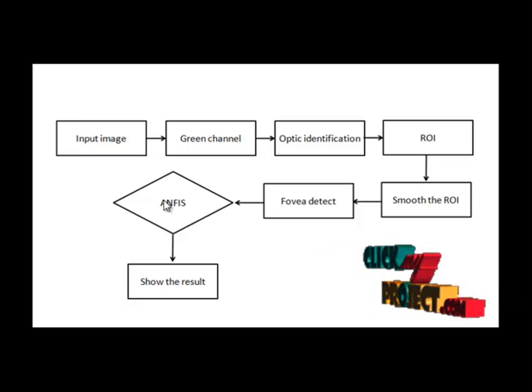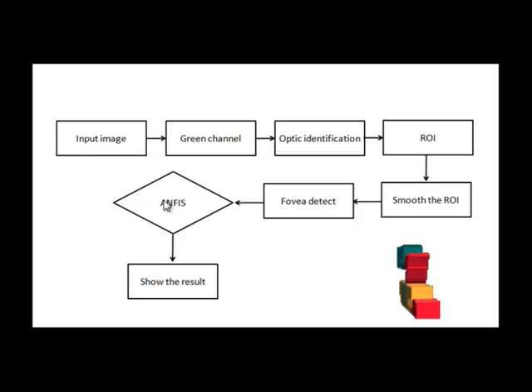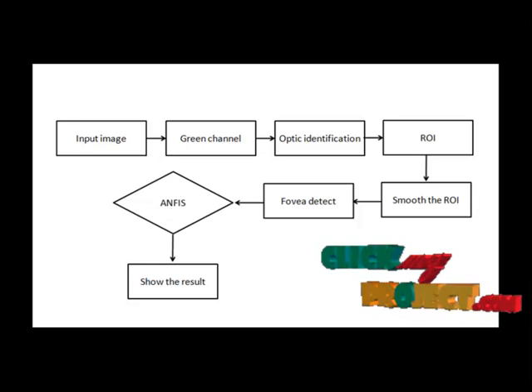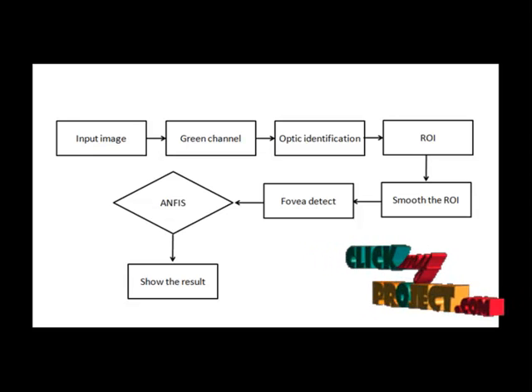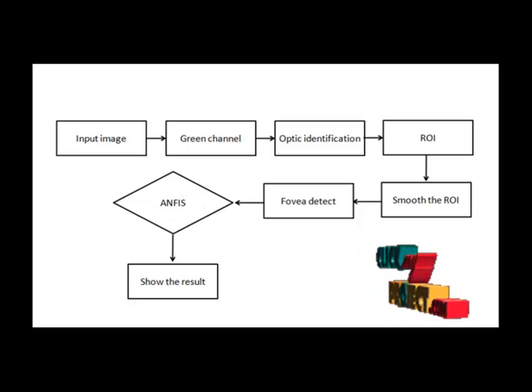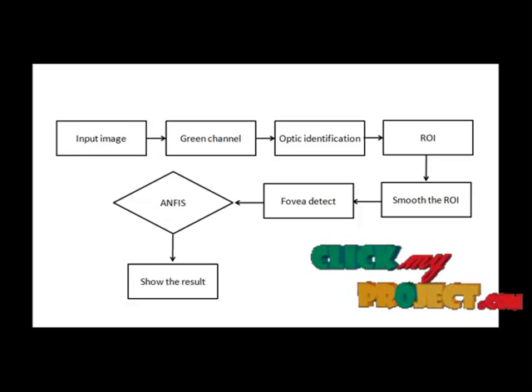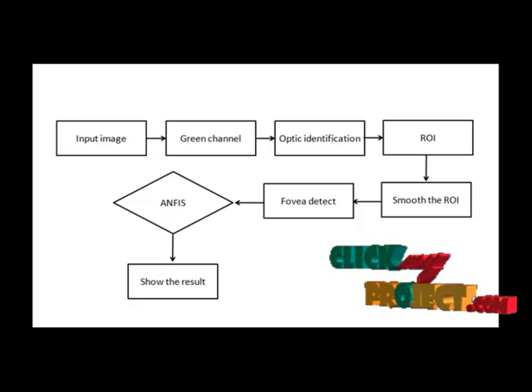When the gradient vector is obtained, any of several optimization routines can be applied in order to adjust the parameters to reduce some error measure. This error measure is usually defined by the sum of the squared difference between actual and desired outputs. ANFIS uses either backpropagation or a combination of least squares estimation and backpropagation for membership function parameter estimation. In the fuzzy system, it will classify the feature by using several rules. Those rules help to classify the data as normal type, moderate type, or severe type.